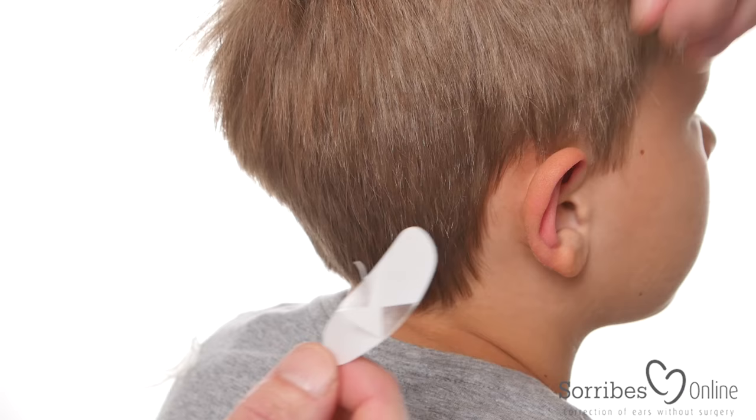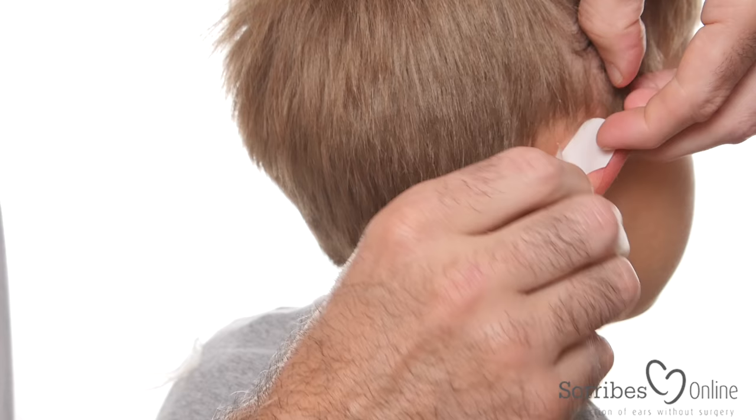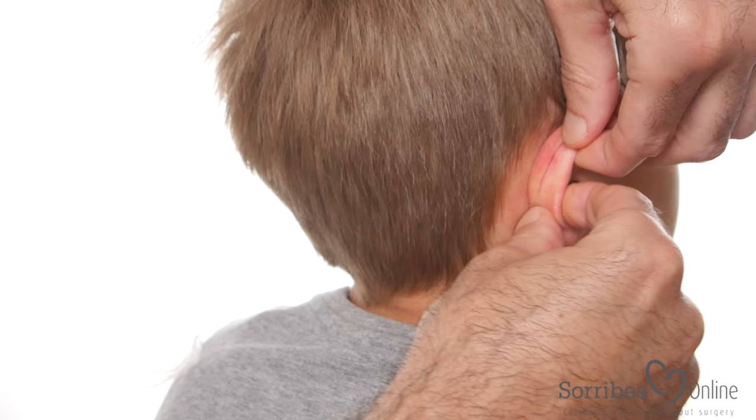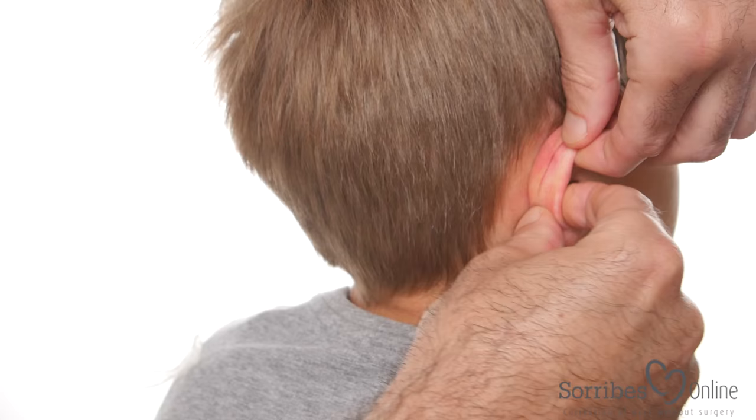There's one for the left ear and one for the right ear. Now we apply the strip to the back of the ear like this. It's completely transparent so it's very discreet and you can use it all day. You bend the ear towards itself making the anti-helical fold. It's important not to bend it towards the head but just towards itself. You have the fold there.